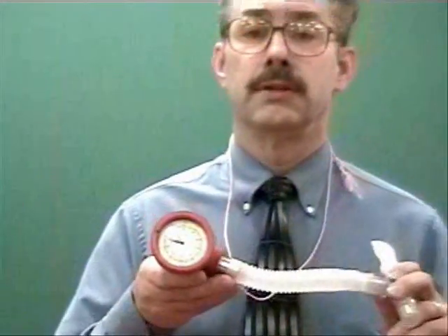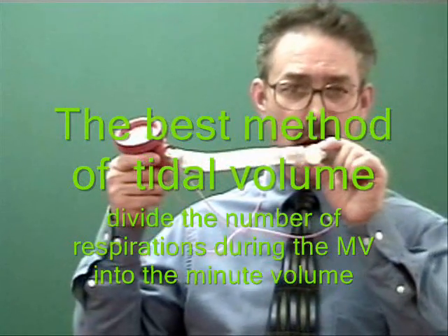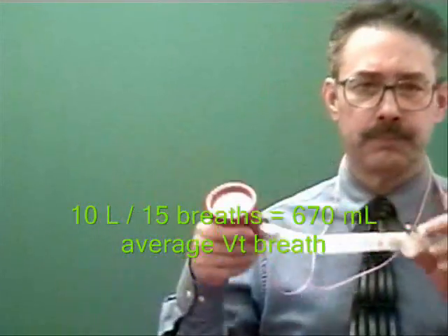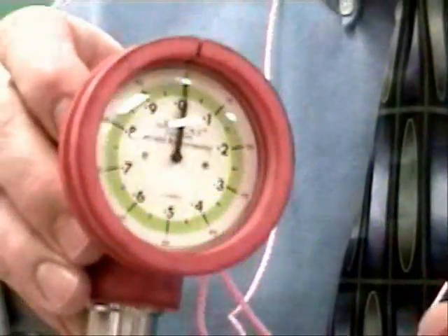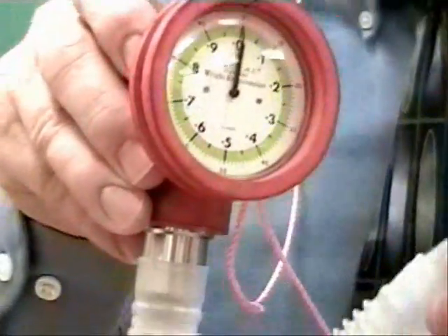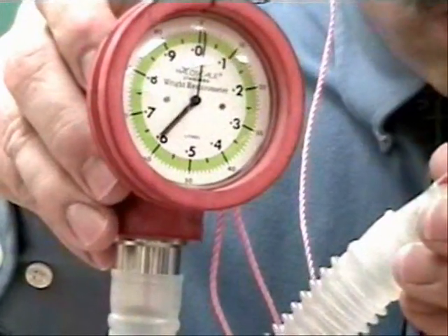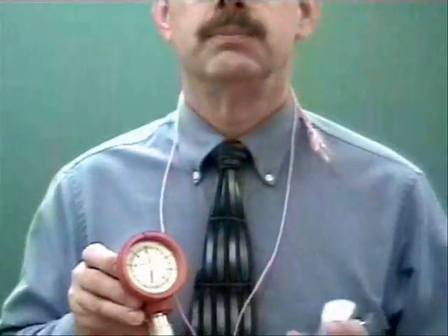Notice that when I was doing this, I did not have to take the unit out of my mouth. I could inhale and exhale right through the mouthpiece. When I did the tidal volume, I reset this between each breath so I could get an accurate measurement of each breath. Big difference between a tidal volume measurement and a minute volume measurement.